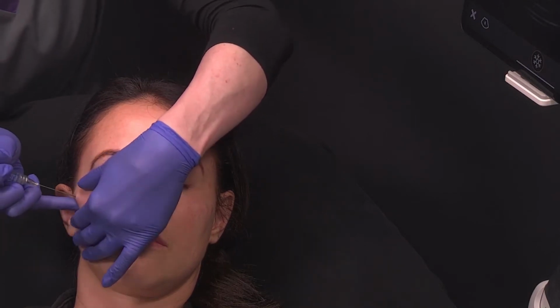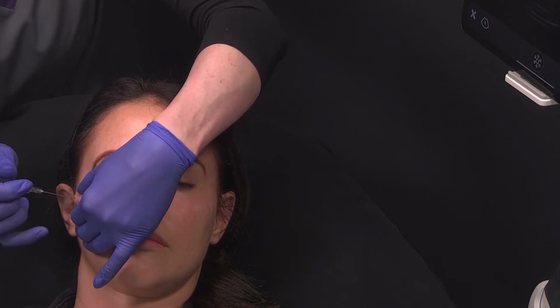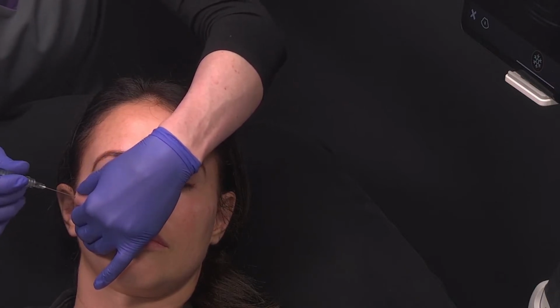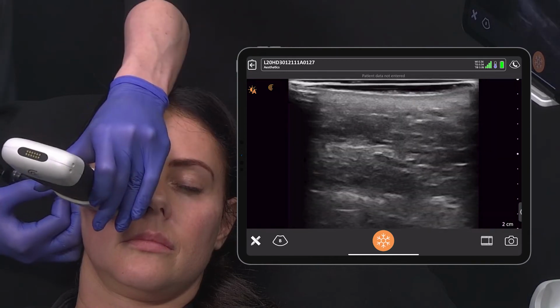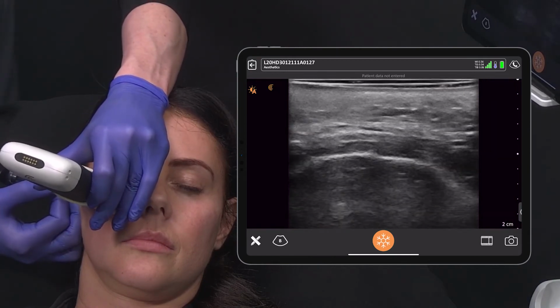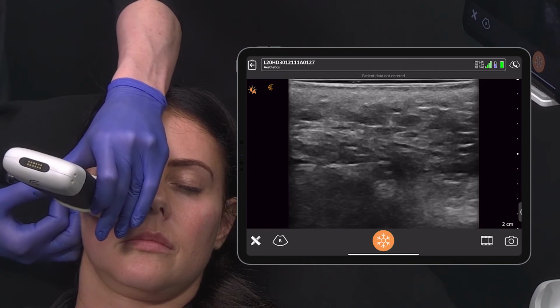I stand behind my patient for better visualization of the developing cheek contour, and I find it gives me better control of my cannula and Clarius. And here I'm using a 22 gauge cannula. Through my entry point, I advance medially whilst maintaining contact with bone, and I can now go ahead and check where I'm at. I gently move the L20. It's important to keep the cannula steady at this point so you've got a chance of finding it.